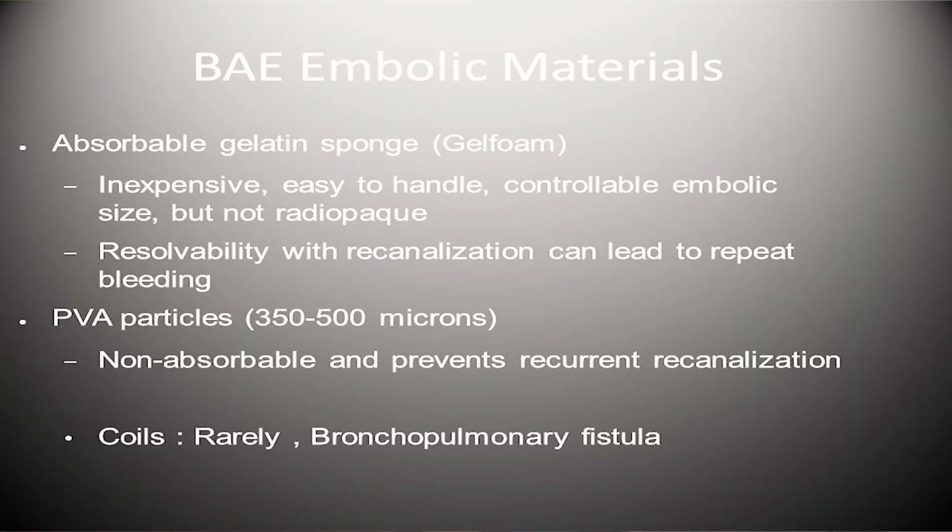But if you put these PVA particles, then it's almost permanent. At least that vessel won't bleed. Something else can happen. Coils, which we typically use for other places, in lungs you don't want to use that, for a variety of reasons.